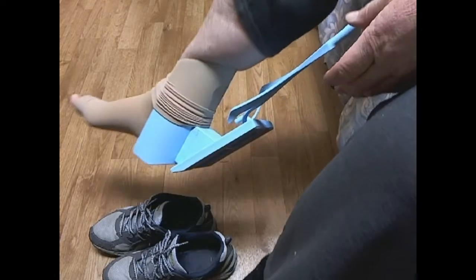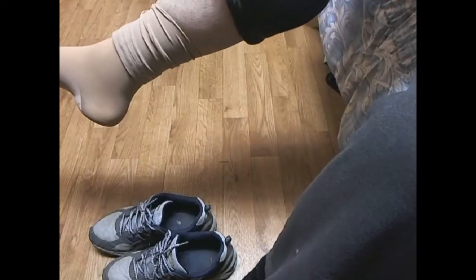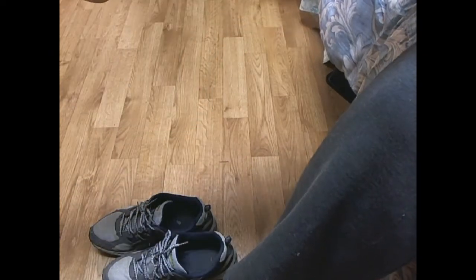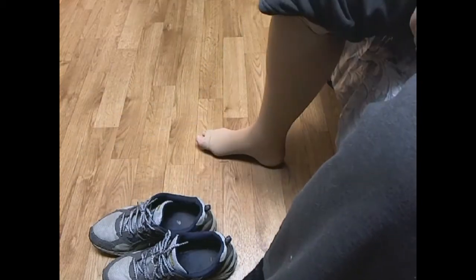So basically the hard part of this is already done. There it is. Okay. Now, it is helpful if you have somebody else, but then you can, making sure you keep your leg at less than a 90 degree when you bend over to reach this far, you can pull them up the rest of the way.